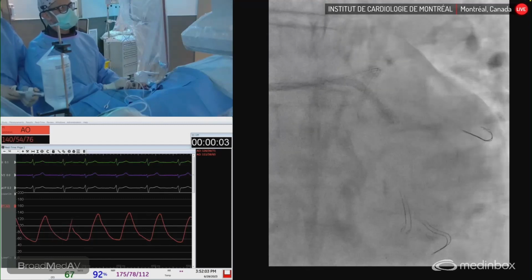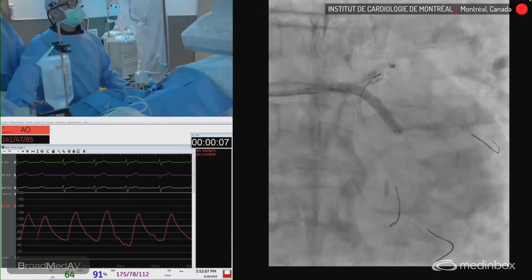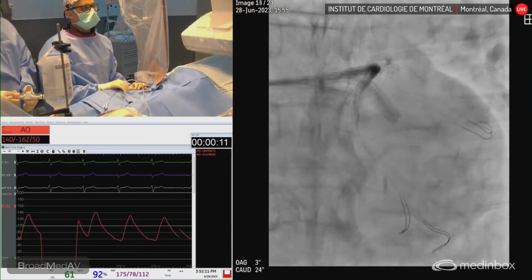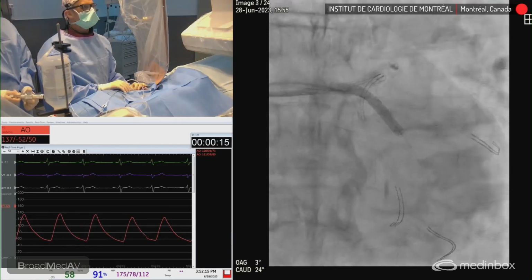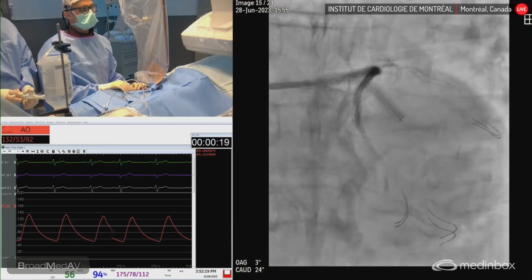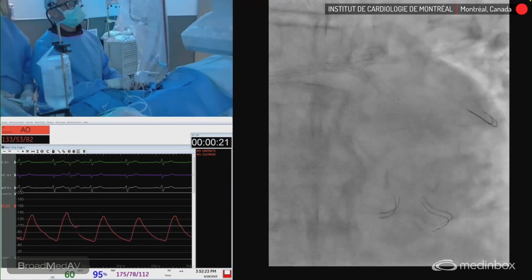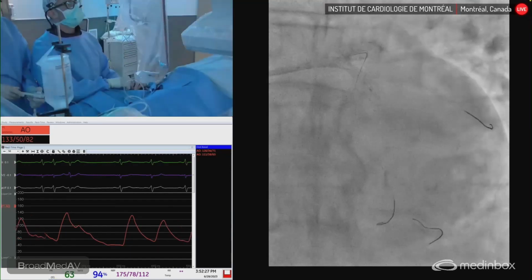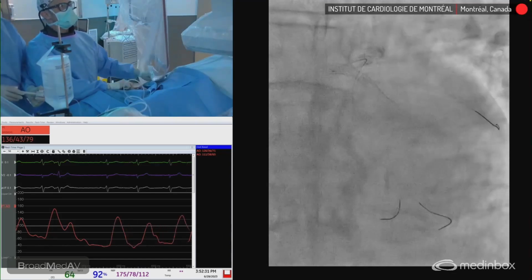10. 14. Pas trop gros pour distalement, là, mais 12 maybe. So we don't cover all the way to the ostium, which is okay because it's not diseased. We do have enough area for pot, and we can see the LAD is okay. I'm just going to pot a bit with the stent balloon first. Yeah, we need to pot. So 5.0 by 8 maybe? Yeah, just a second. Ce ballon 5.0 non compliant, s'il vous plaît.